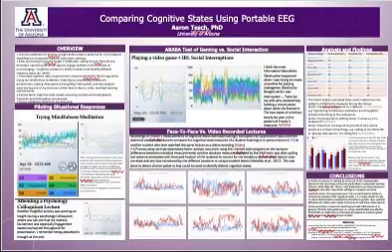Another activity that I did while wearing an Emotiv was playing video games. So I'm a big fan of the idea that video games could be used as teaching tools. So I wore the Emotiv during sessions of gaming.